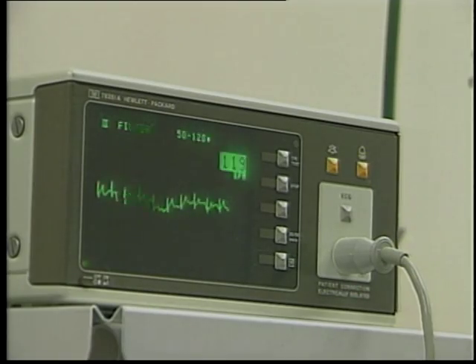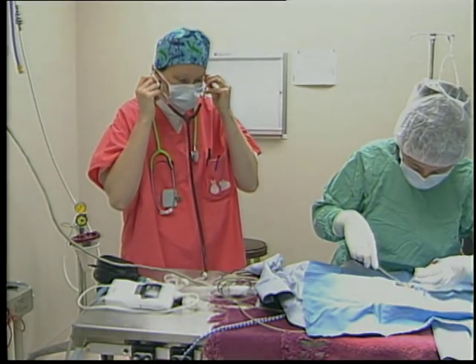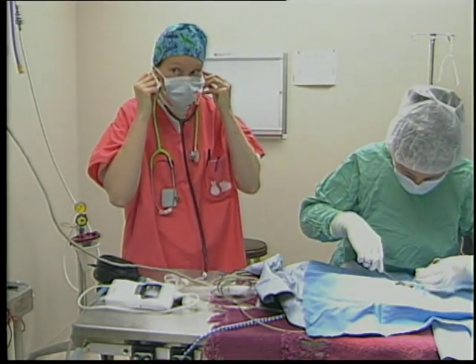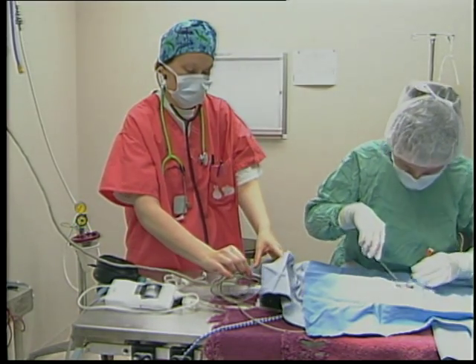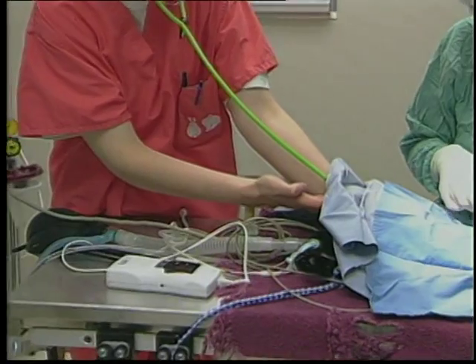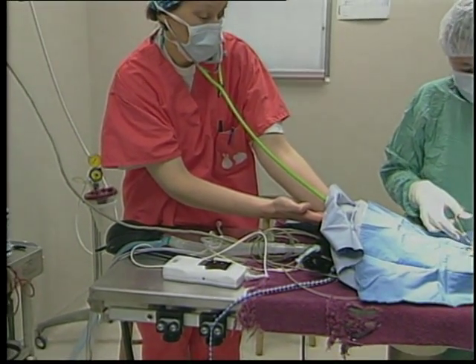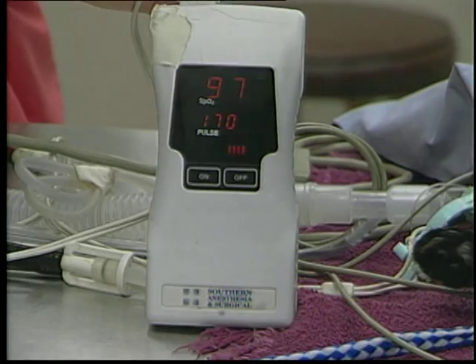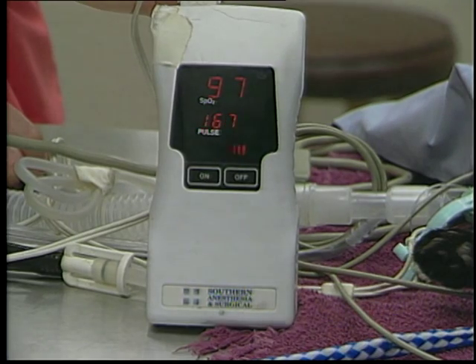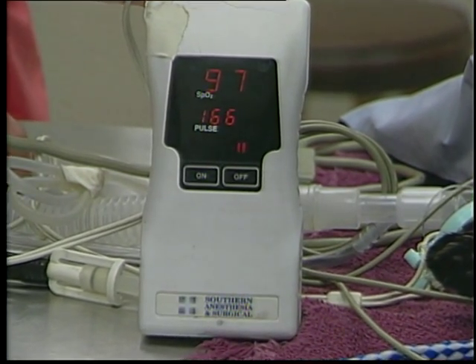circulatory changes. An esophageal stethoscope works by placing a hollow sound tube down the esophagus in the vicinity of the heart. From here, you can easily monitor the heart. A standard stethoscope can also be used on the patient's chest, but be careful not to disrupt the sterile field. The pulse oximeter is especially useful because it monitors both heart rate and blood oxygen levels.